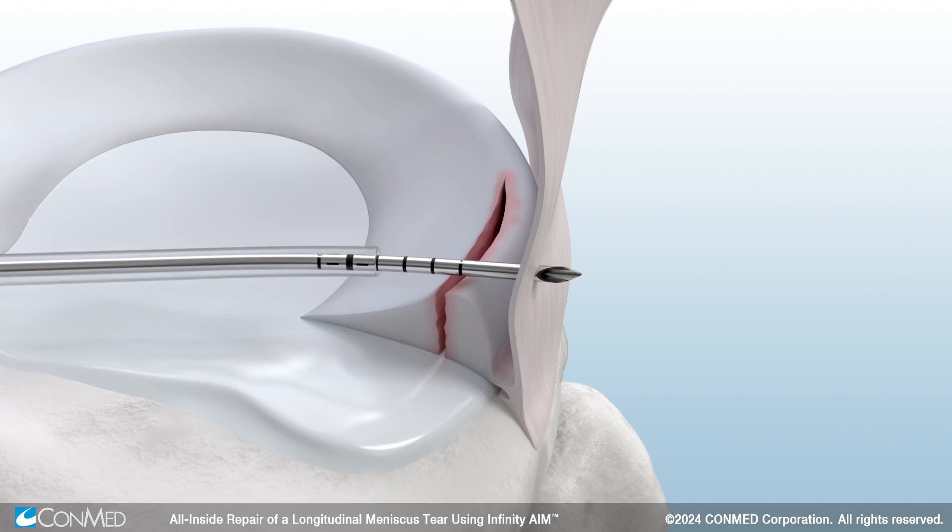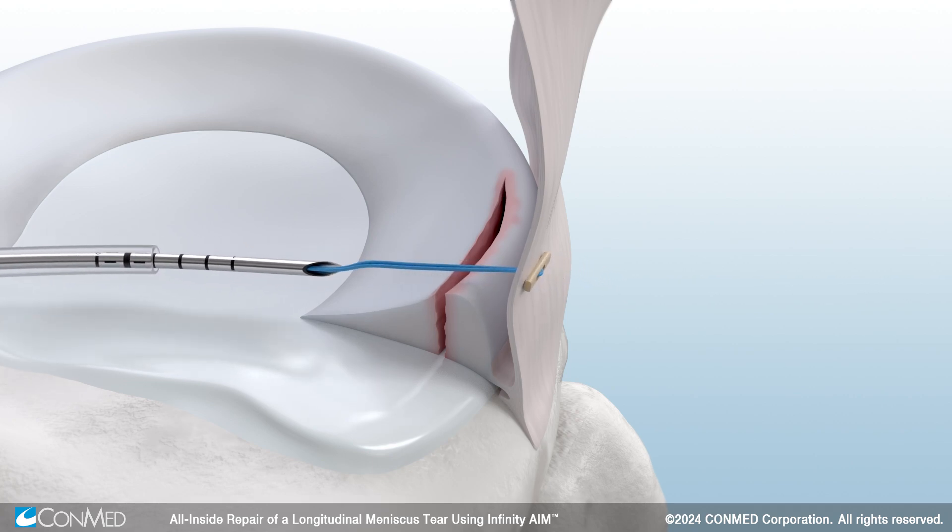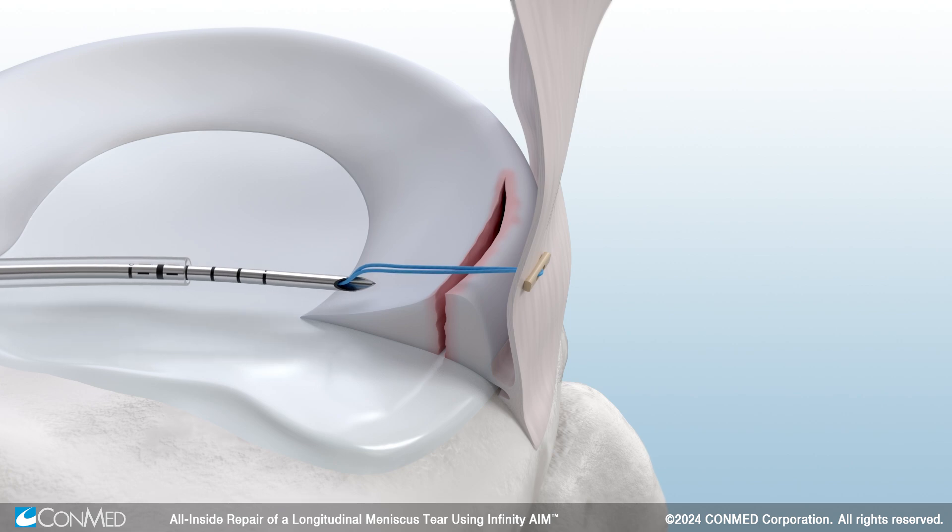Then pierce through the capsule. The trigger will automatically reset and load the first implant for deployment. Then withdraw the needle from the meniscus, pulling the needle back with enough suture slack to reach the next piercing location.